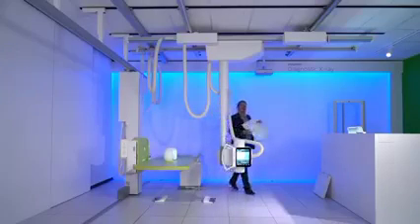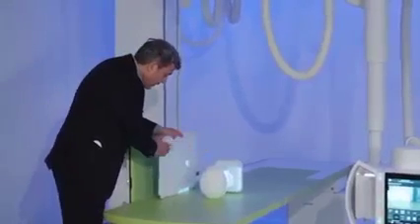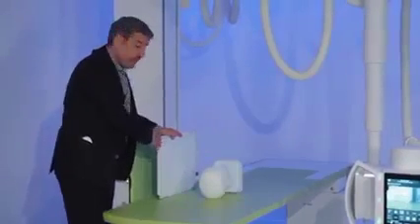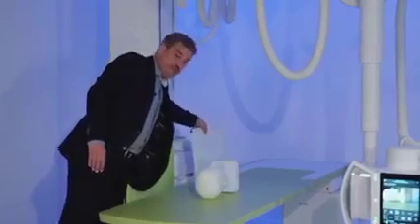The only way to do this, if you will not have such a movable wall stand, is to use a wireless detector. A wireless detector that anytime you have to put next to the patient, it's done with a manual exposure technique, and every position you have to move this detector accordingly.